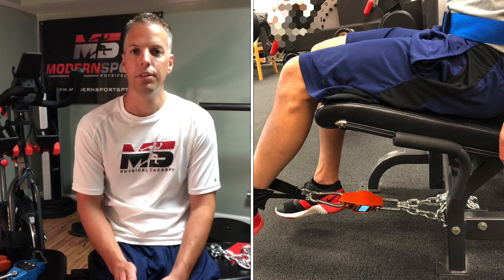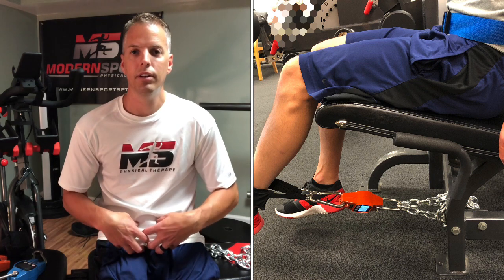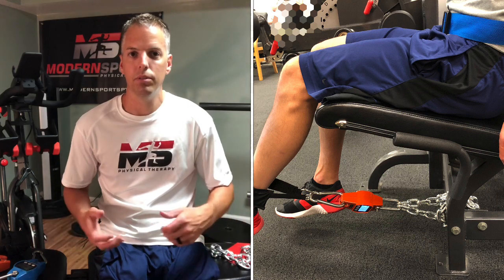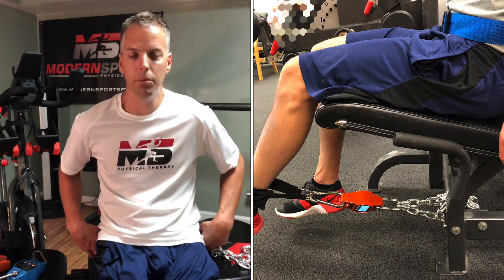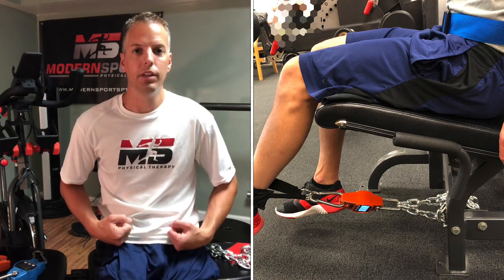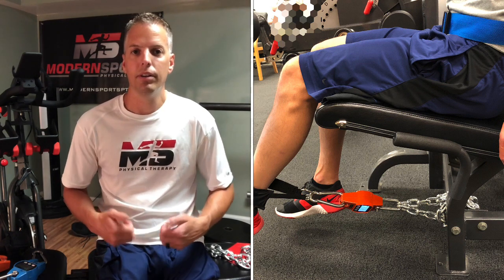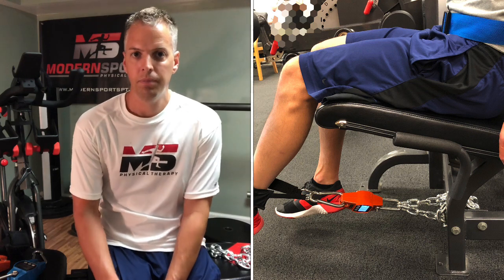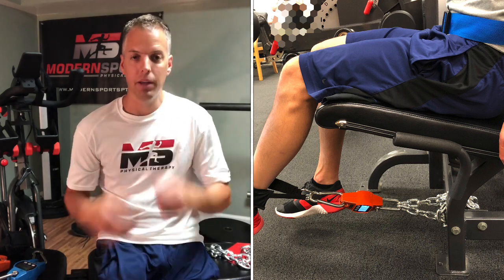An important thing about the setup is to make sure their hips are secured down. I use a mobilization belt — something with a clasp works really well, like a seat belt type mobility belt. You definitely want to anchor the hips down so they don't fly up out of the seat when they kick out. You want a really isolated measurement of quad strength, so hands are across their chest and they can't hold on to the side.